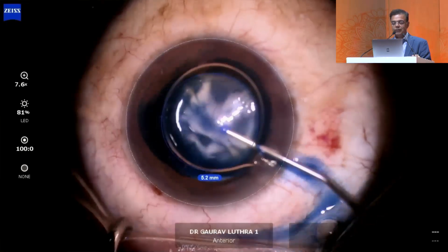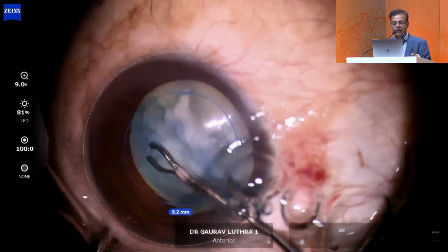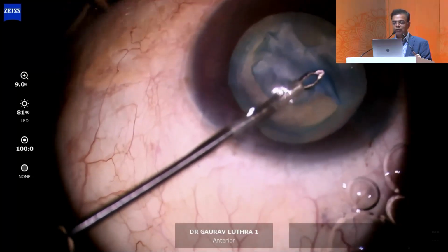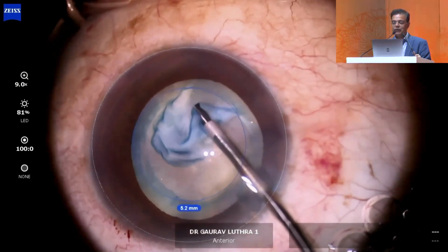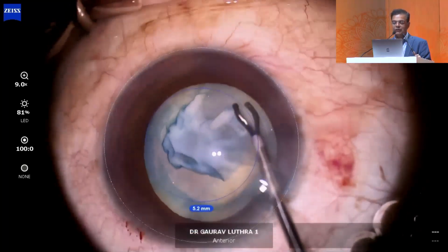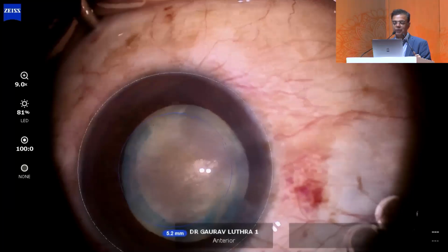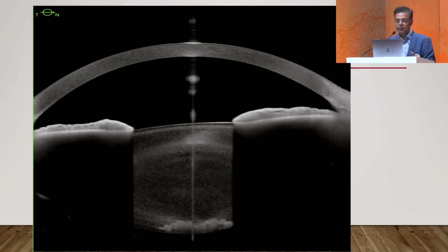laser. Now you must stain these capsules, and I have seen a very brilliant video by Dr. Ramamurthy as well, who shows very nicely the same thing. You can see that the template has been formed, and while it may not be a free floating rhexis, it does give you a very, very good way to, just like a postage stamp, just deal with it. Because otherwise the only other way would have been to run a micro incision, micro scissors, and cut these capsules, because there is no other way to deal with them. So a femto assisted situation here works extremely well, and you can see that it was a very fibrotic cataract, and then of course the rest of the surgery is mostly uneventful.